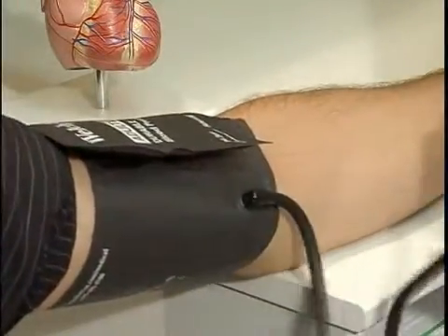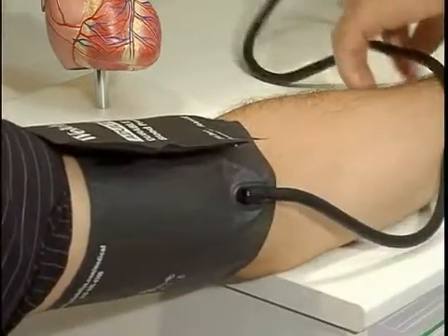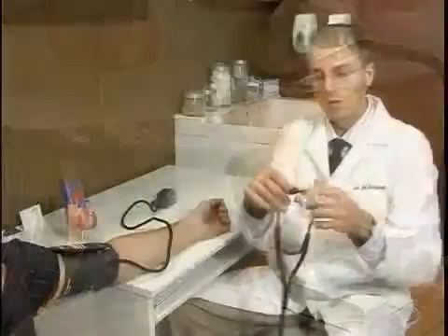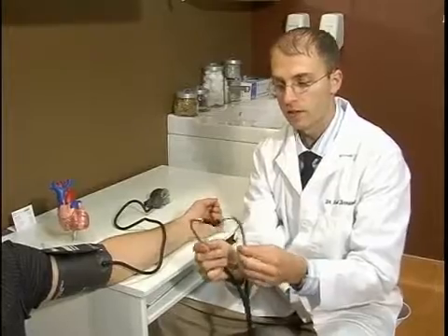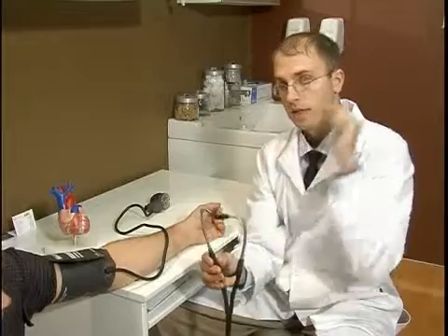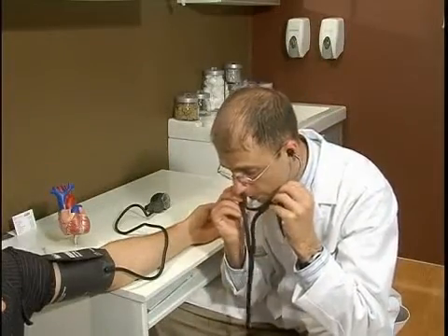Go ahead and close that off. Now we have that, and the next part is placement of the stethoscope. One important aspect is to make sure that the ear pieces are angled, and you want to make sure those angles are pointing forward when you place it in your ears.